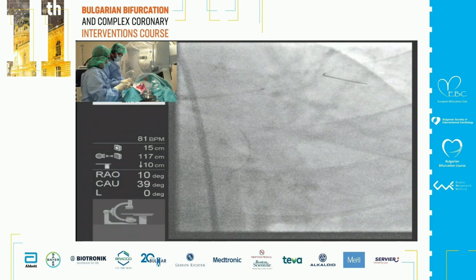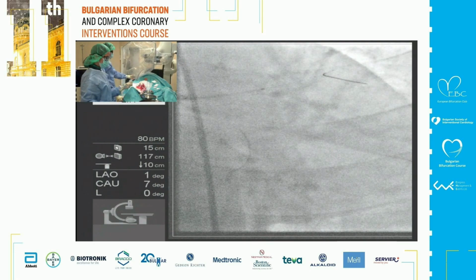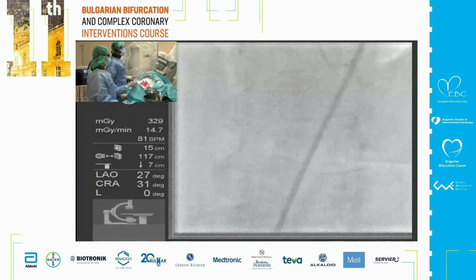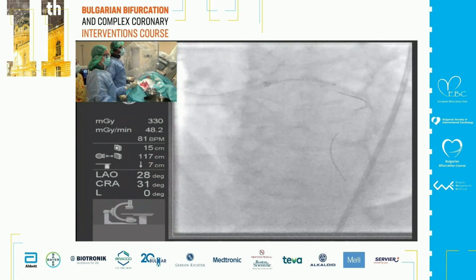George, you said we are in a fellows course. I know that some people say, okay, I can always put a wire for sure, and I would say probably I will be able to put a wire in any situation. But this is not a good message. No, the reason that I'm asking is not to avoid it.